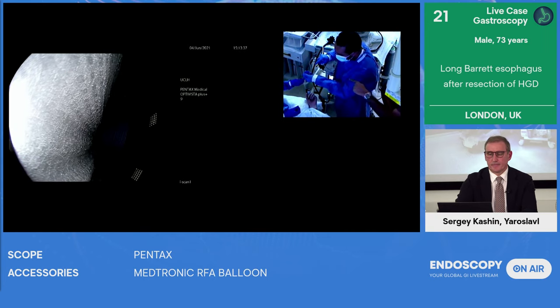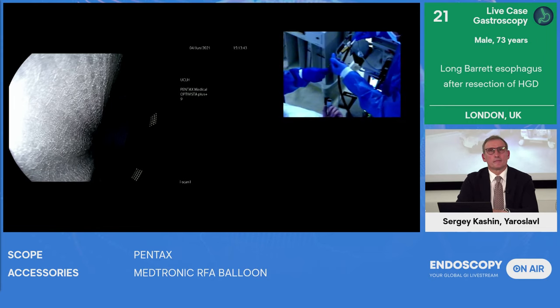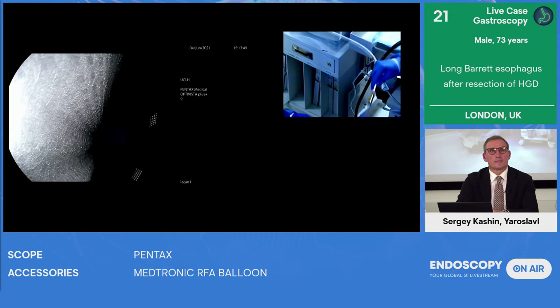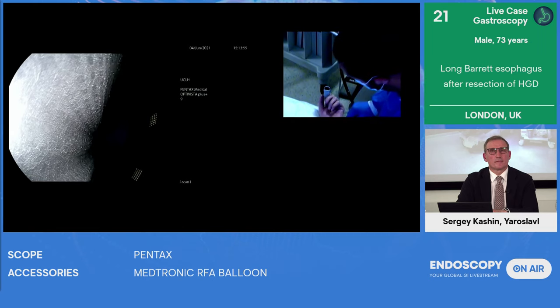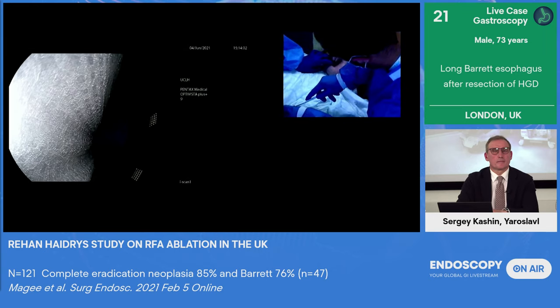So can we just focus in on Vinay's hands here, team? So you can see that he's got this 4-centimeter RFA Express device, which was introduced several years ago and has really helped to streamline delivery of RF ablation because it's a self-sizing catheter, which means it auto-sizes to the minimum diameter of the esophagus. So Vinay's just inserting the device down now. Vinay, any tips and tricks of putting this in?